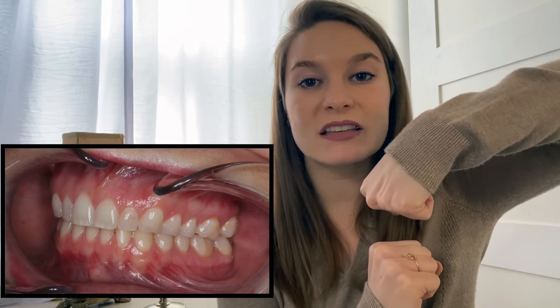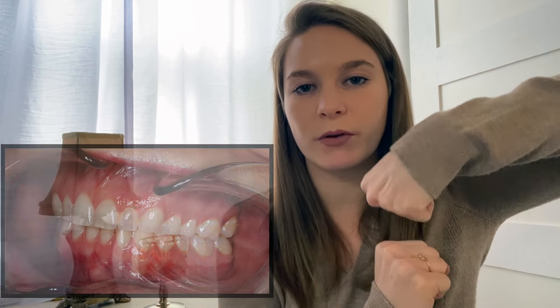Here is a video of the very last time that I bit all of my natural teeth together, followed by my new bite in the splint. With my normal bite, my condyle — the ball of the jaw joint — was further back in the joint than it should be, and the way that my teeth came together when it was in this position is like this.